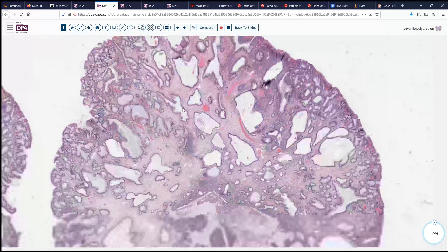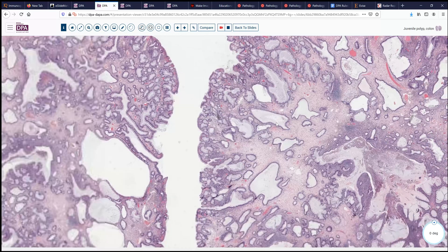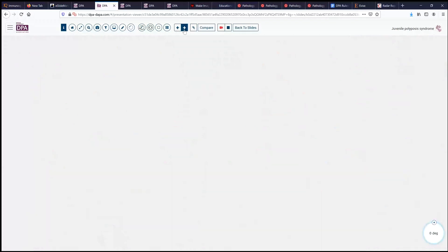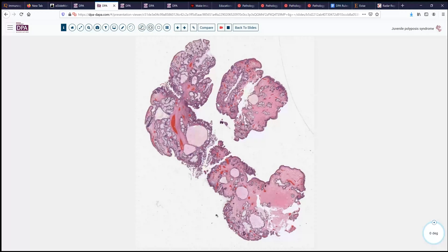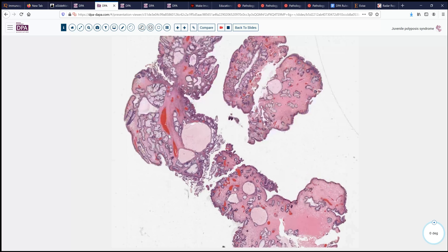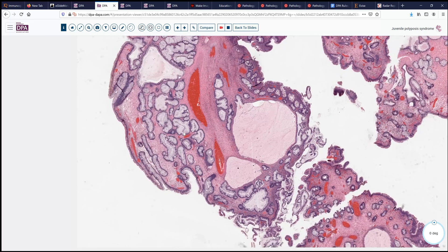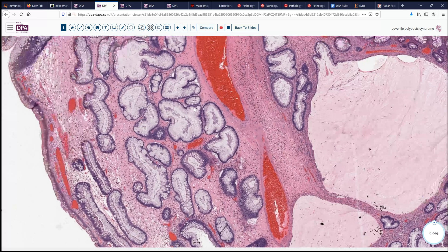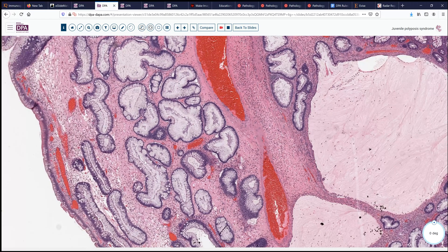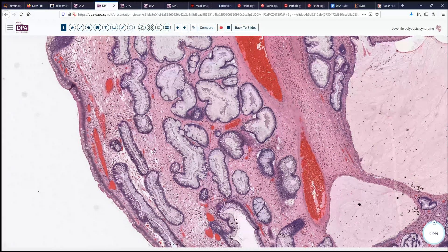Seeing these areas of eroded surface mucosa with some reactive changes and vessels is another feature that often unifies these polyps, because they're subject to trauma in the fecal stream — the surface mucosa can get rubbed off by fecal material passing by. Here's another example to see the variation on the theme. We again see at low magnification these deep glandular dilatations and vessels. The epithelium looks to be complex glandular, with basally oriented, non-atypical nuclei and otherwise normal stromal elements.